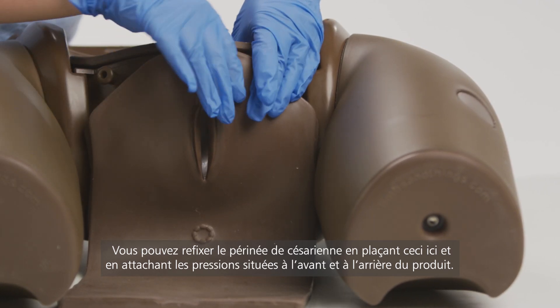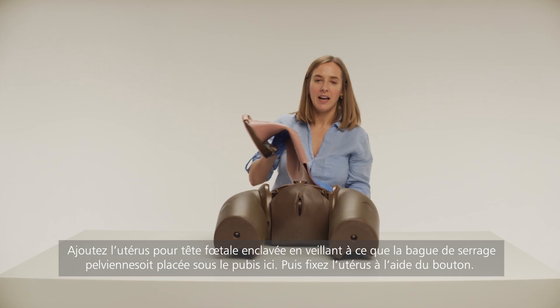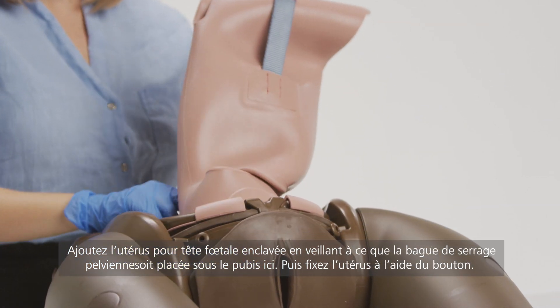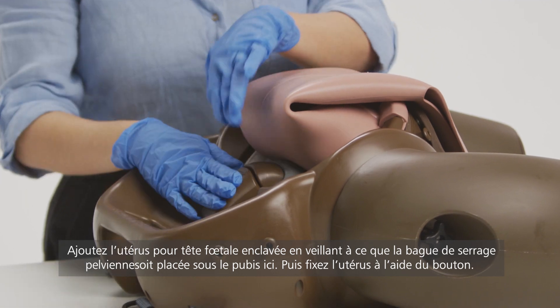Attaching the poppers at the front and back of the product. Add the impacted fetal head uterus, ensuring that the pelvic ring clamp sits under the pubic bone here. Then secure the uterus in place by twisting the knob.